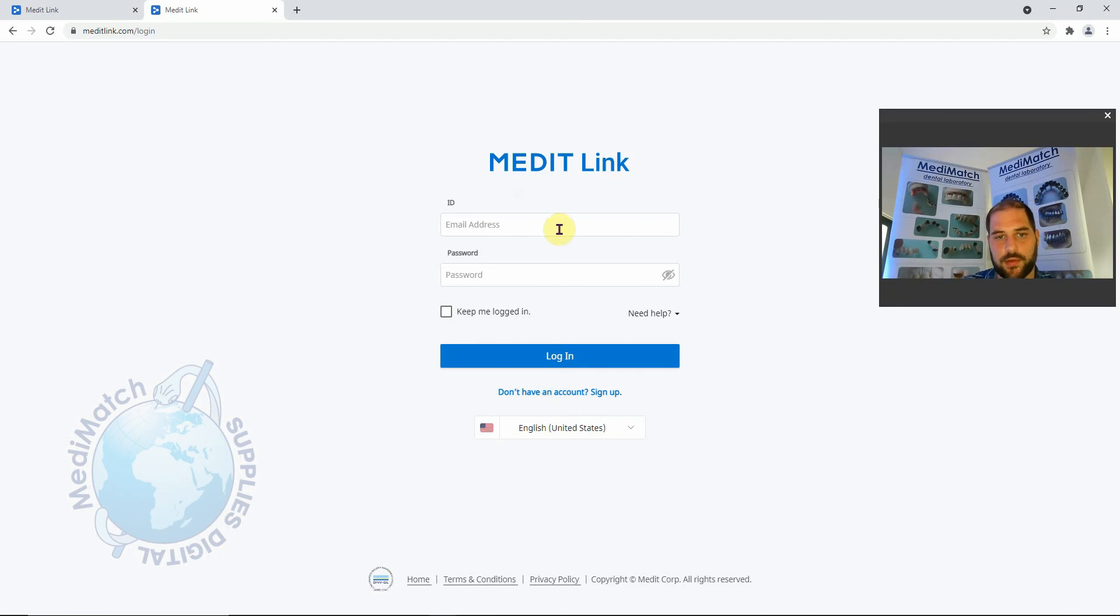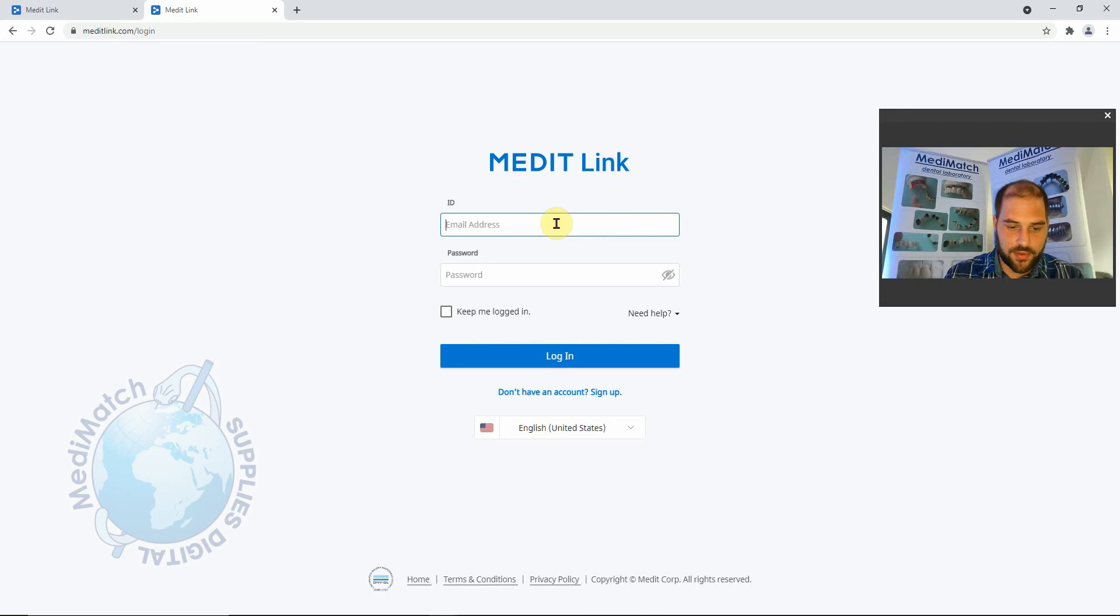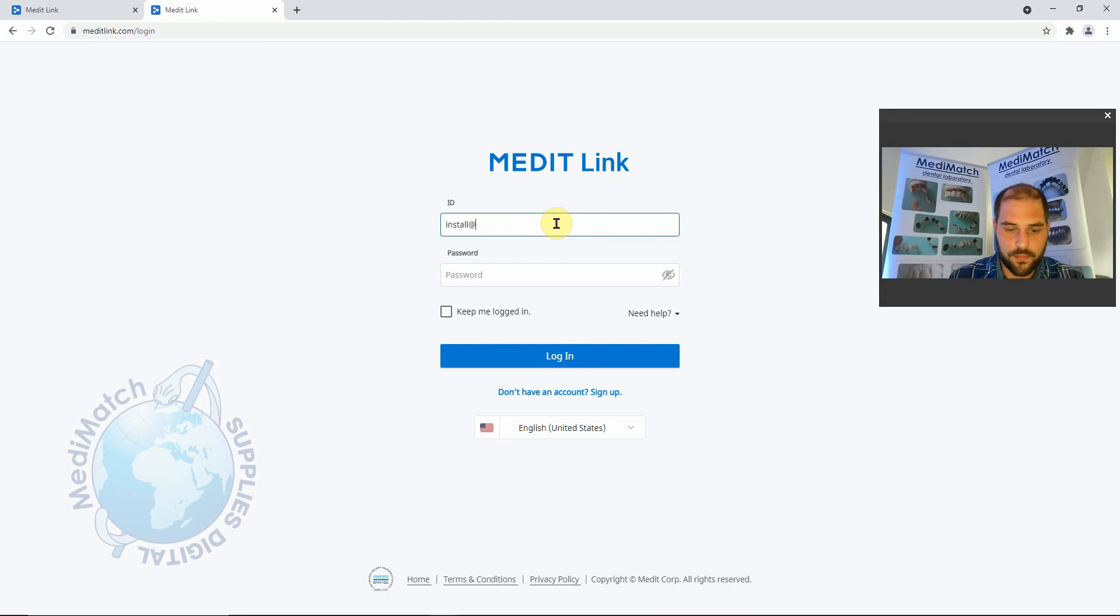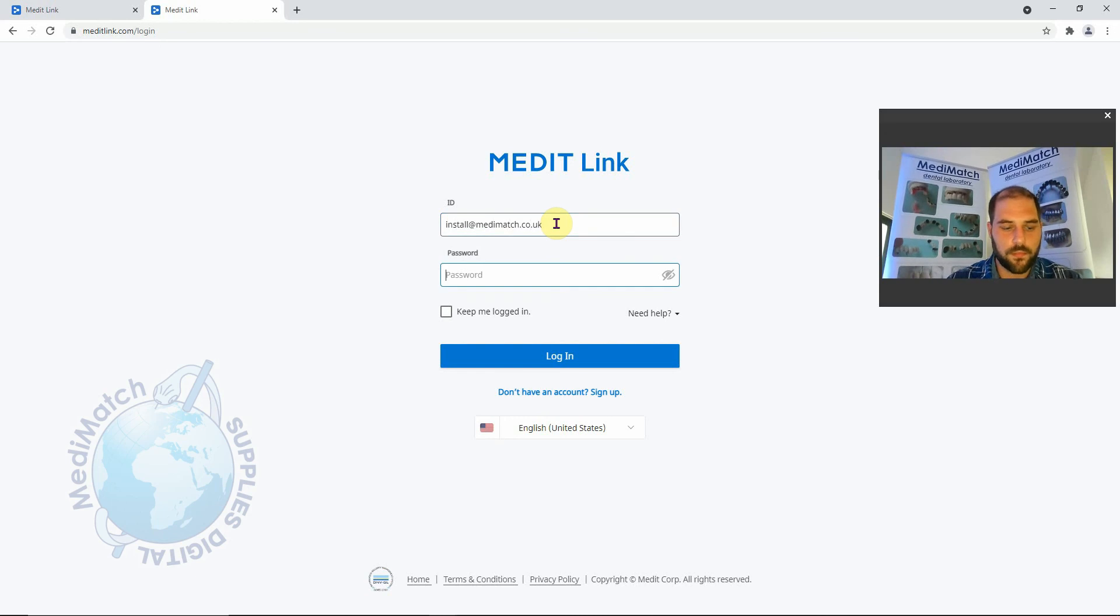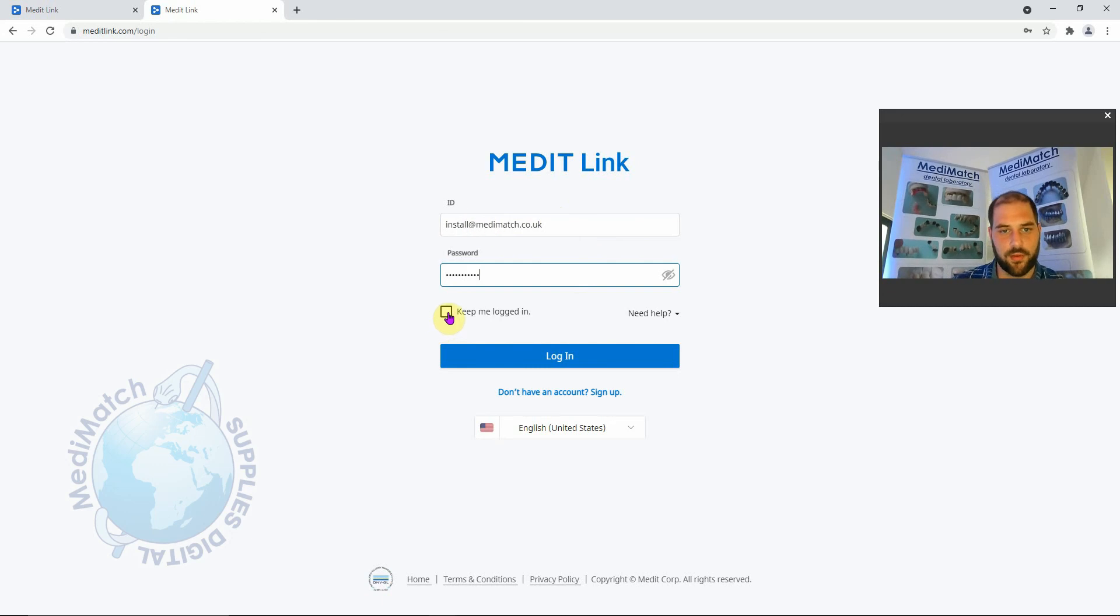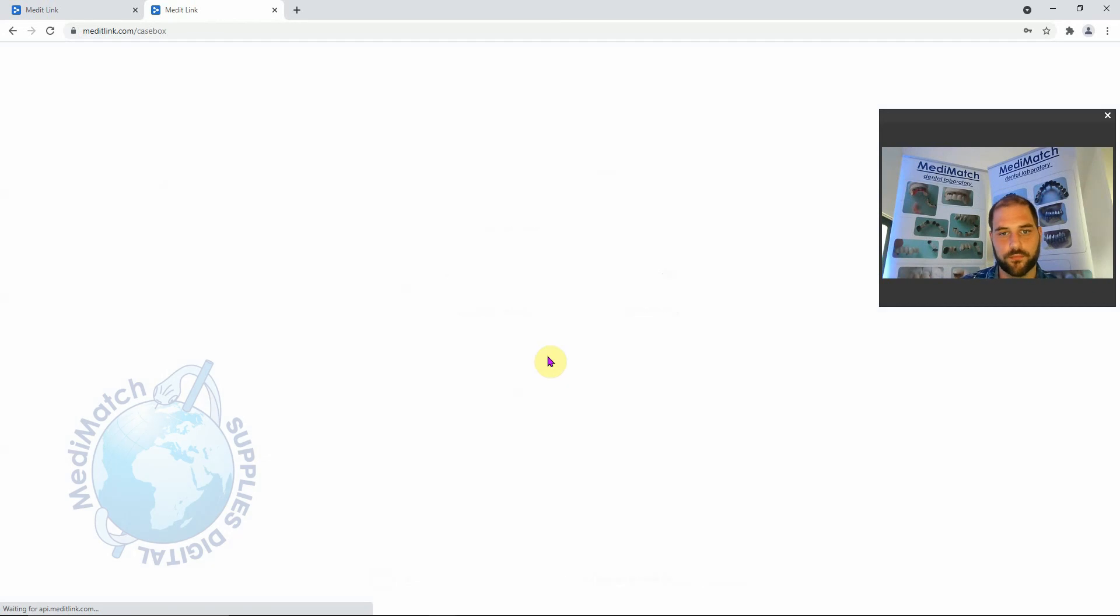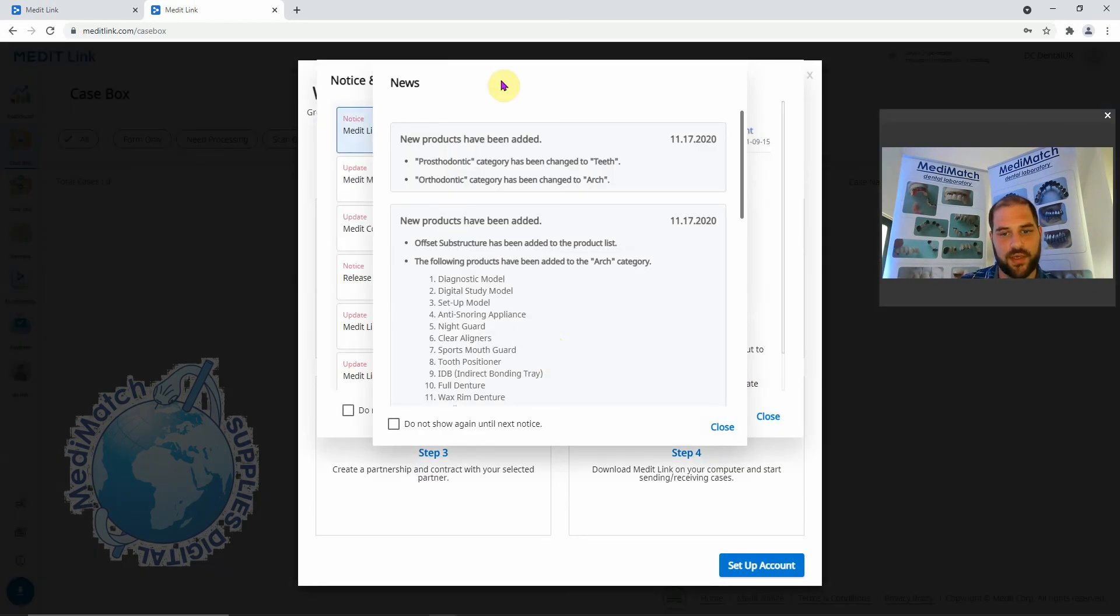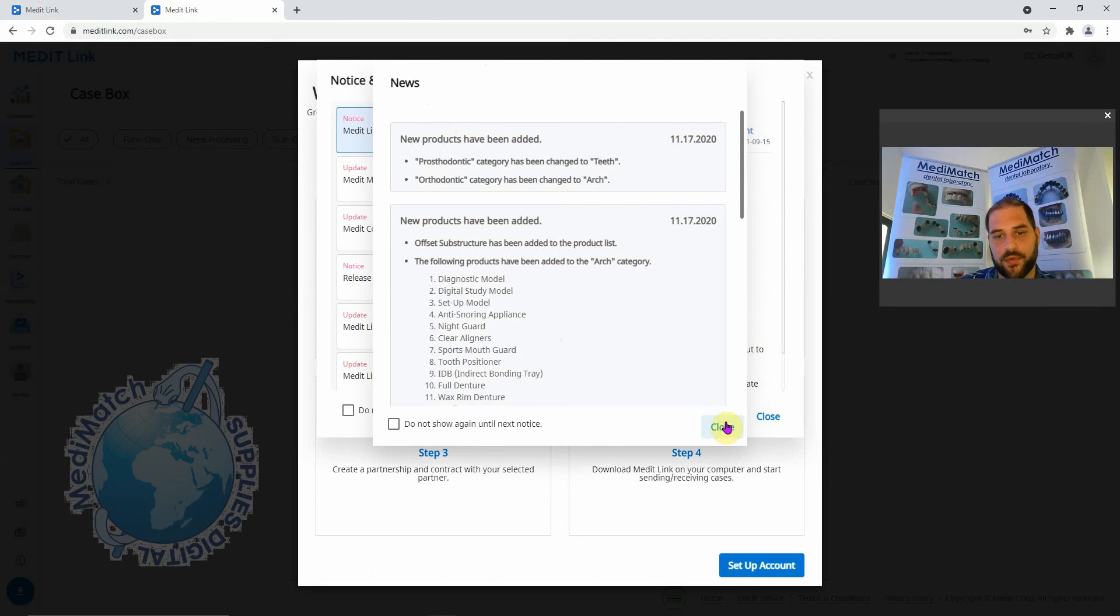We're now going to put in our information that we've just registered with. If we keep the tick on keep me logged in, you won't have to put in this information every time we log in. These pop-ups here come up when you log in when there's any new announcements or any updates available or pending updates. So we can just close these for now.